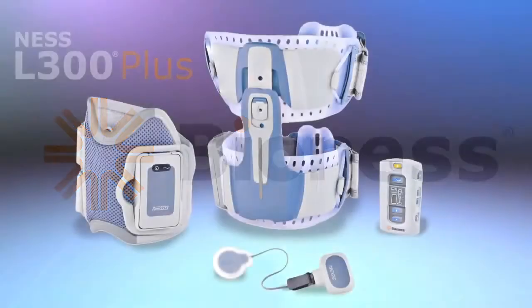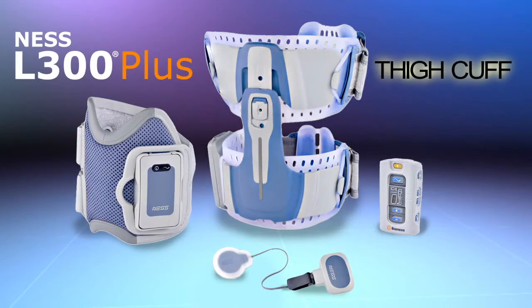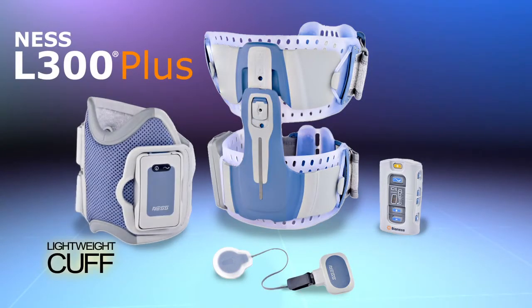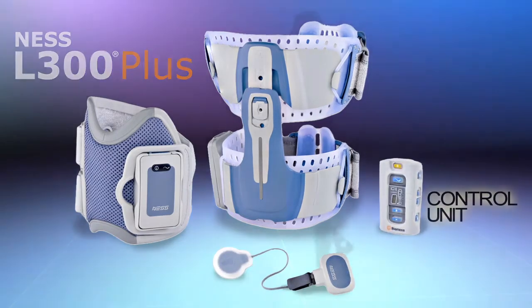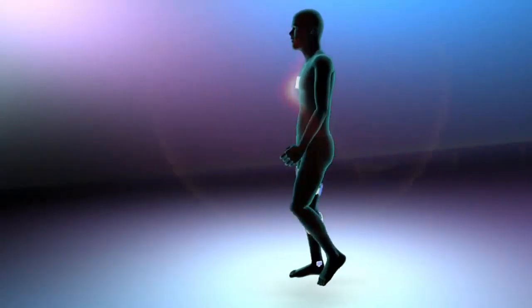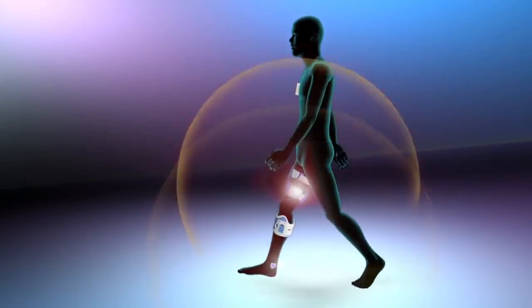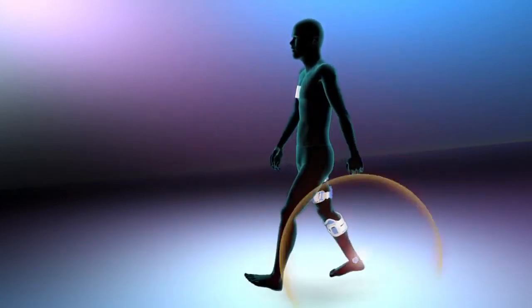The Ness L300 Plus system consists of four main components: a thigh cuff that fits above the knee on the quads or hamstrings, a lightweight cuff that fits below the knee, a small gait sensor placed in the shoe, and a wireless control unit, all of which communicate wirelessly, eliminating the need for troublesome externally worn wires and connectors, making the system simple and easy to use.